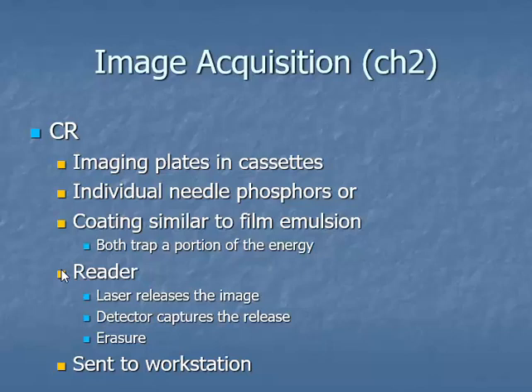The artifact specific to needle phosphors that we identify is that whenever one or more of those needle phosphors stop working, we have what we call a dropout artifact.